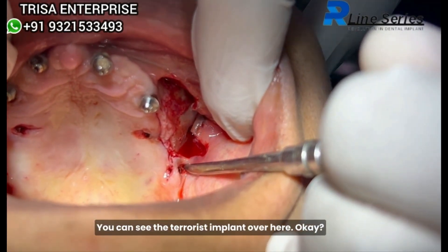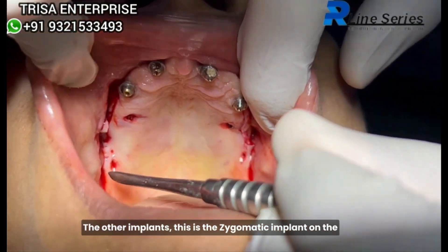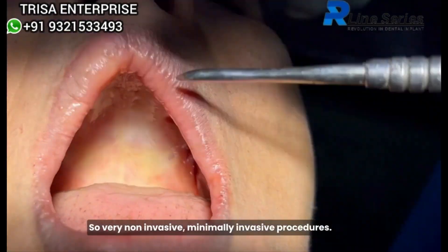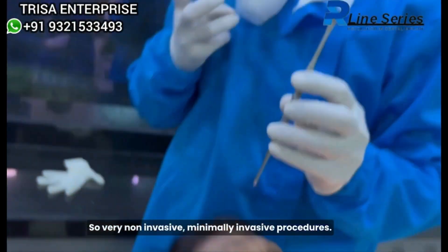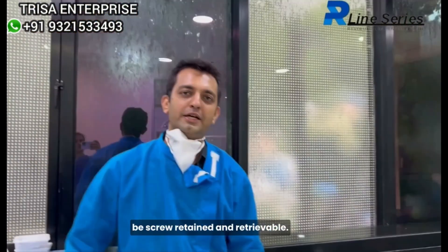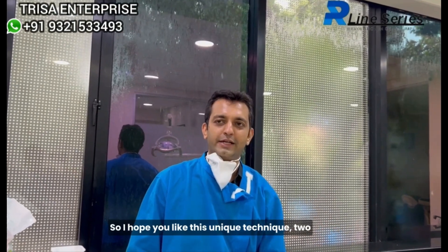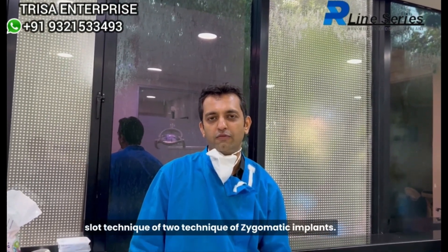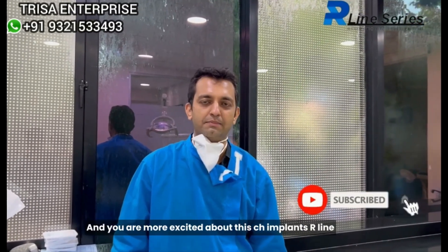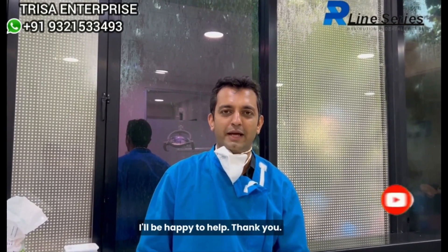You can see the pterygoid implant over here, and this is the zygomatic implant on the right side and my pterygoid implant on this side. Very non-invasive, minimally invasive procedures, and most importantly everything will be screw retained and retrievable. I hope you like this unique two-hole technique of zygomatic implants. If you are excited about these CIH R-Line implants, put your queries in the comment box — I will be happy to help. Thank you.